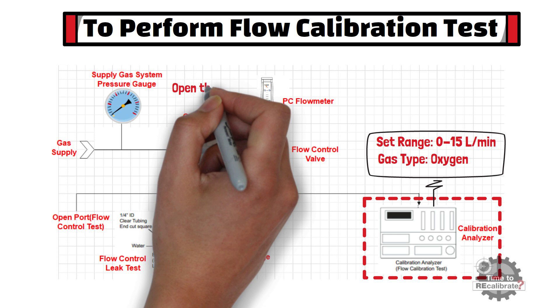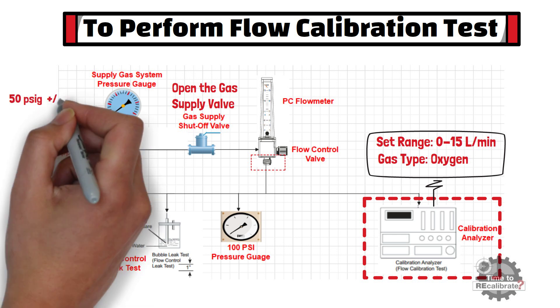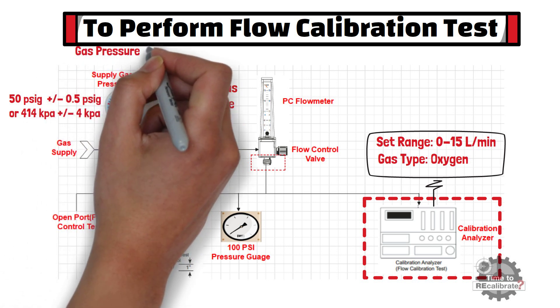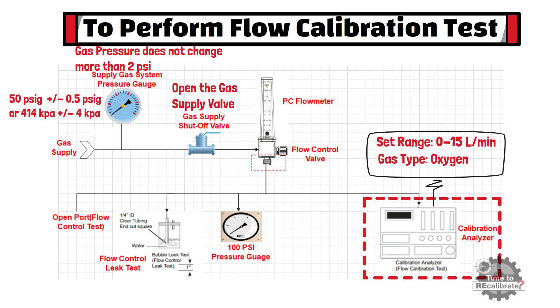Now, first of all, open the gas supply shutoff valve. The next step is to set the correct pressure as shown on the flow meter label. For example, set the pressure to 50 pounds per square inch or 414 kPa. Make sure that the gas supply pressure does not change more than 2 pounds per square inch when flow is adjusted over the full reading range. Now we are all set to perform the 5-point verification test for the oxygen flow meter.